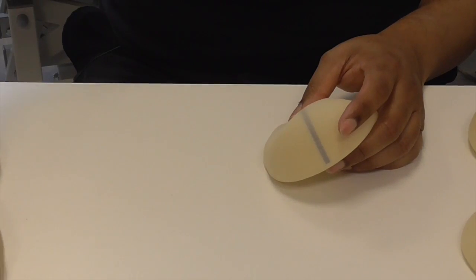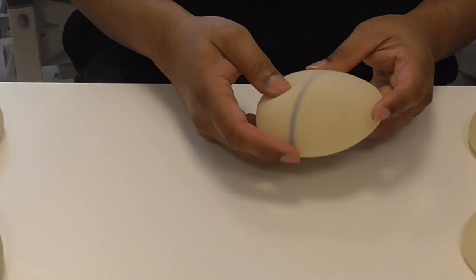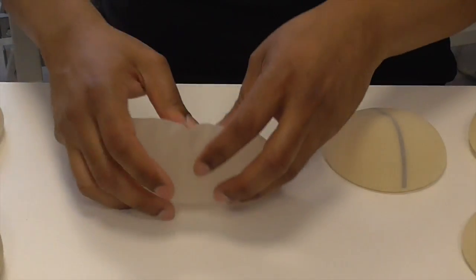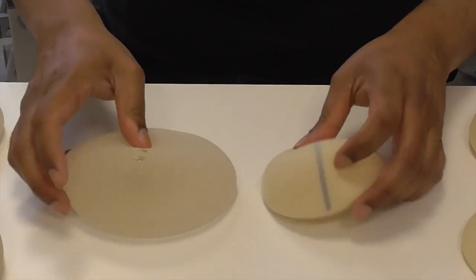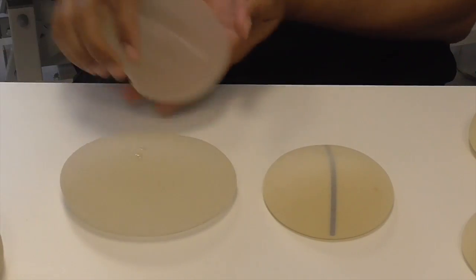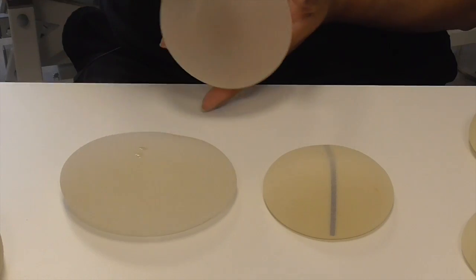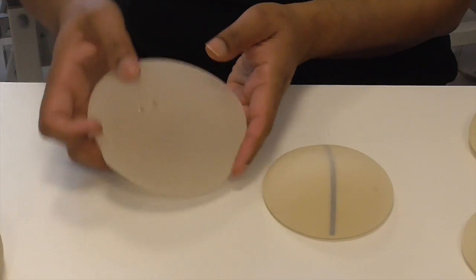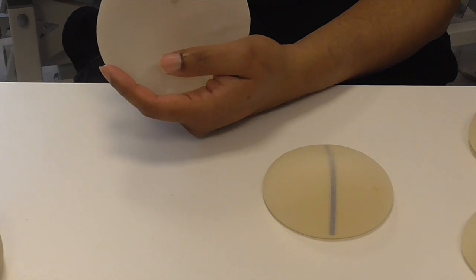We have different sizes, different texture coatings, and different shapes. When you're putting in an anatomical implant, as opposed to a round implant which you can put in any way and it can spin around with no problem, you don't want to put an anatomical implant upside down because that obviously will not give you the kind of aesthetic outcome you want.